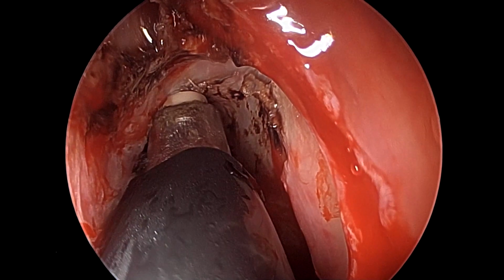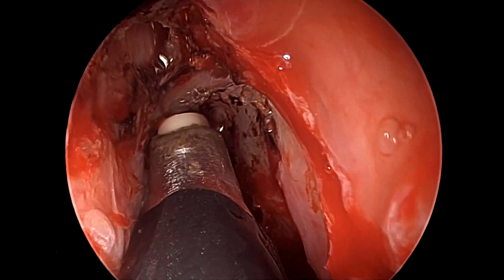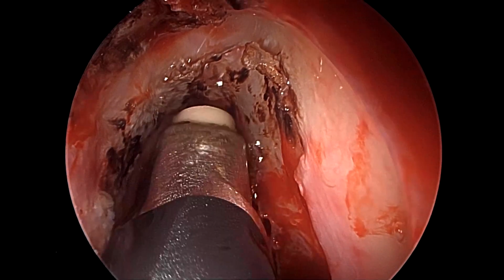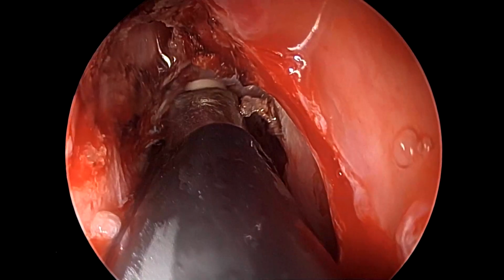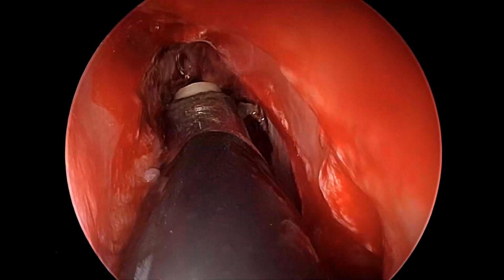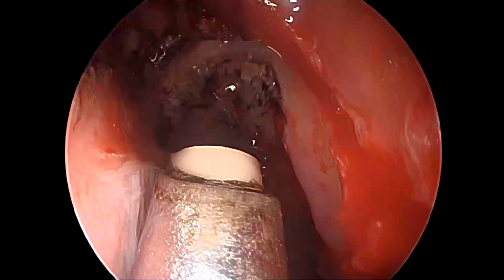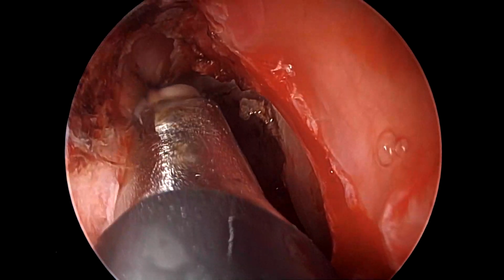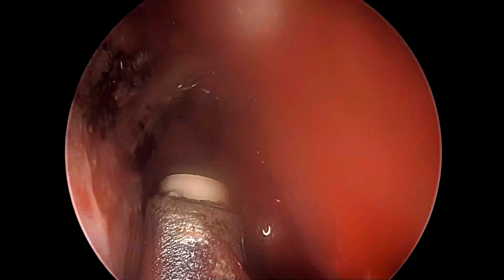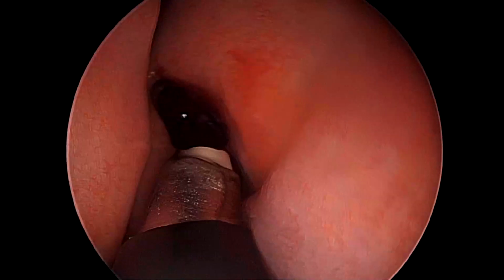So once again, we are just using coagulation mode again and again on the defect proper, on the erstwhile meningocele that has been reduced and is now no more in the picture. The coagulation wand also allows us to palpate the skull base defect throughout to coagulate it nicely, because otherwise the moment this is contacted with our elevators, this could lead to oozing or bleeding from the dural vessels if the area is not well coagulated.